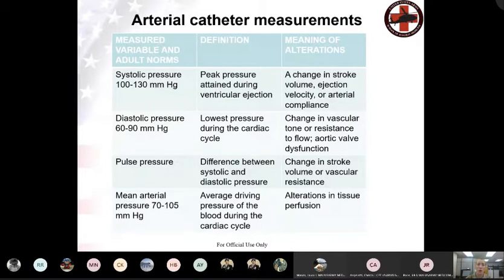So if my patient's heart rate increases by 10% and I didn't do anything to cause that, I probably need to start looking for something and doing a little bit of a deeper dive into my assessment so that I can provide an intervention. If we fail to notice those trends early, we can get very far behind the power curve, and then it's just a bad day for all of us as we kind of chase our tail to get right with what our patient needs. So I'm going to strongly encourage you guys, as you move into simulation and are downrange completing this mission, to consider your baseline vital signs and what a 10% change is, and then having that troubleshooting conversation with your partner to determine, hey, if this happens, then we're going to do this. This is what I would suspect. Okay.